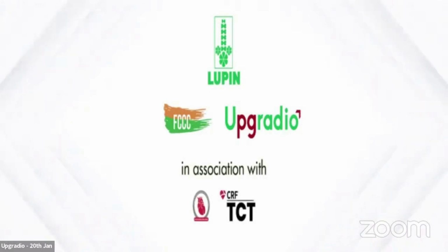Sometimes when you feel like it's a CTO lesion and you are supposed to have a good backup support, I would say transfemoral is going to have more backup support compared to transradial. So whenever you feel like, okay, this is the case where you do need to have a good support, and there is possibility that you are not going to get good support via the transradial, that's the time one can shift to the transfemoral access.